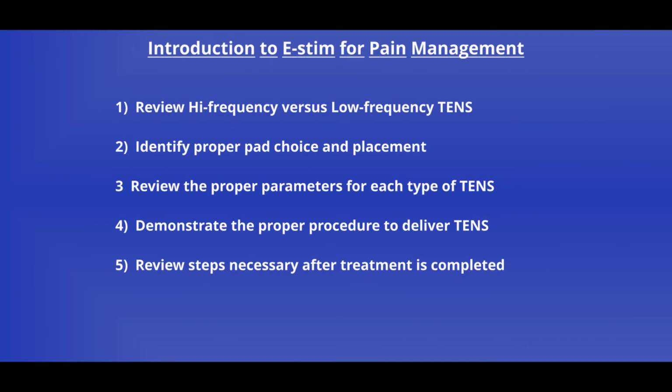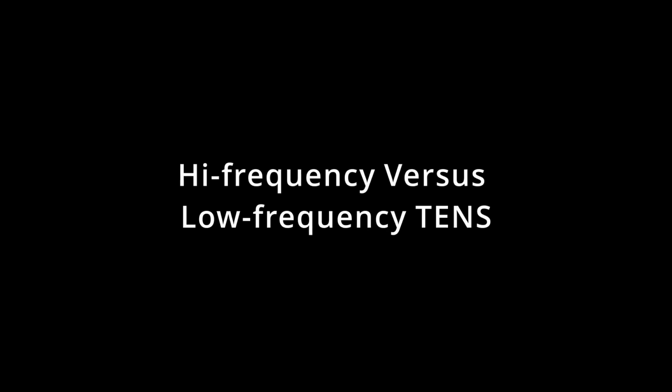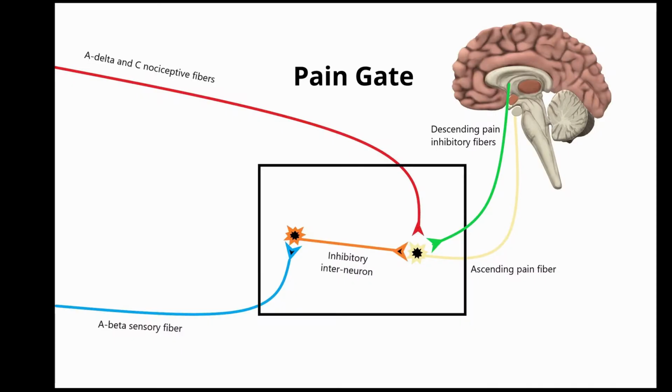We'll talk about the differences between high frequency and low frequency TENS, talk about proper pad placement and choice, review the parameters for each type of TENS, and we'll demonstrate how to apply TENS properly. The main difference between these two types of TENS is the mechanism they use to help decrease the pain.